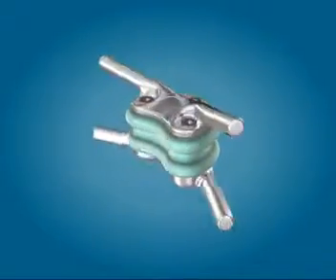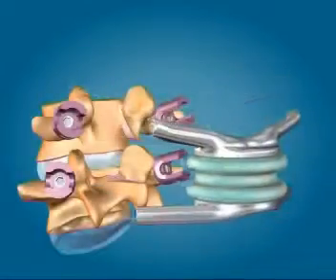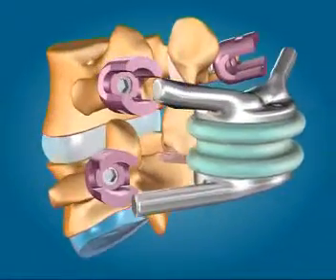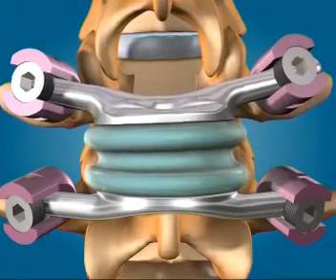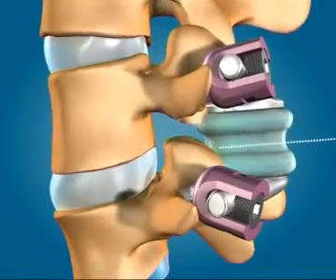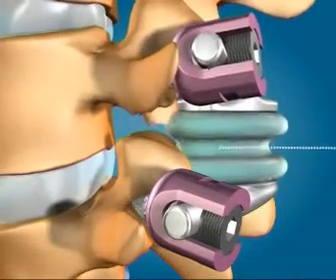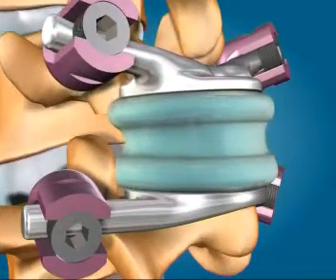Welcome to the TOPS Surgical Technique Training CD-ROM. TOPS is a total posterior spine system that is indicated for patients with degenerative spinal stenosis, facet arthrosis, and grade 1 spondylolisthesis. The purpose of this video is to introduce you to the TOPS instrumentation set and to provide you with key tips for preoperative planning and a smooth surgical procedure.